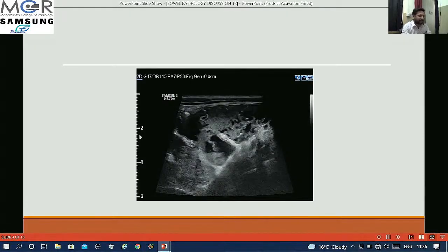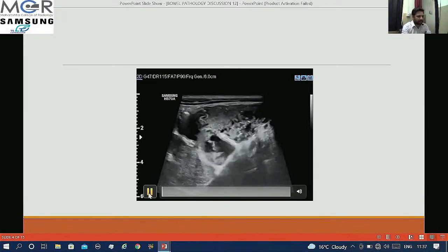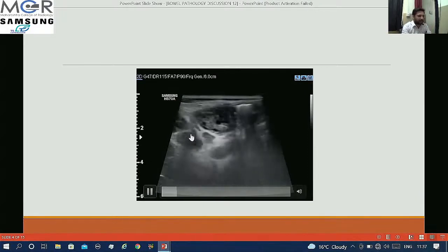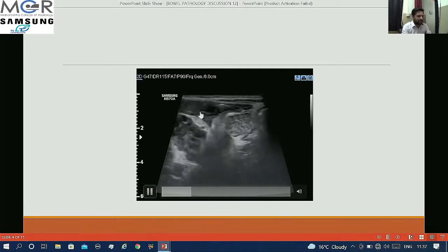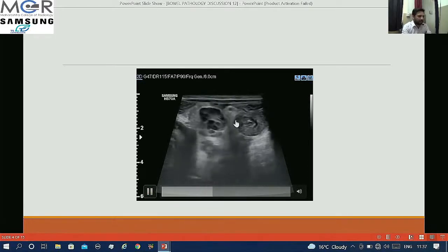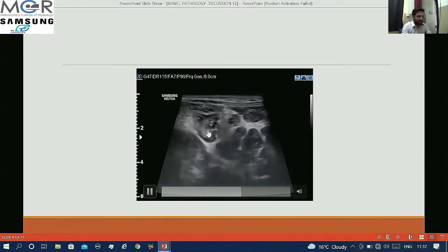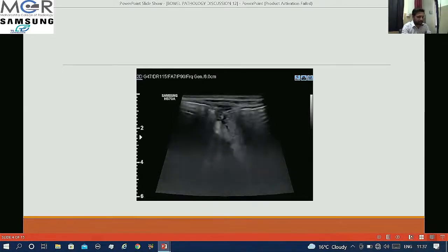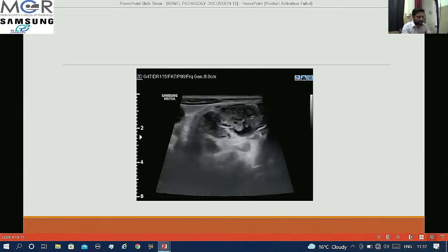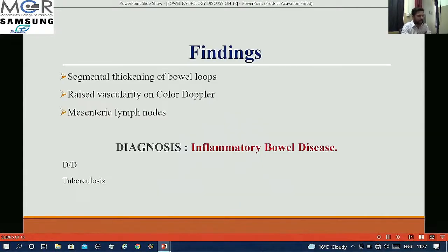This is another case with similar complaints. We can clearly see that this patient was having significant segmental thickening in the bowel wall with lymph nodes, raised vascularity on color Doppler, and echogenic calcifications were also seen within.